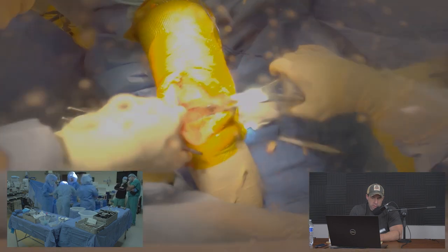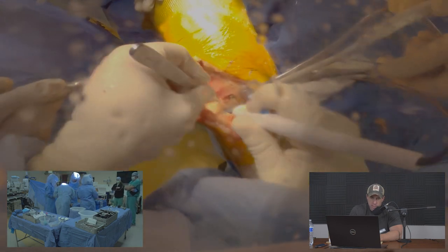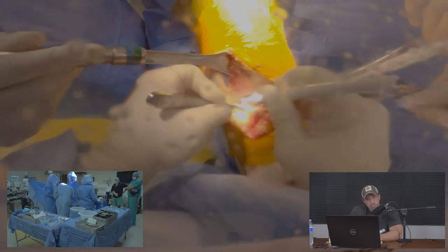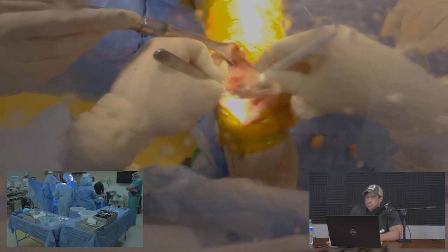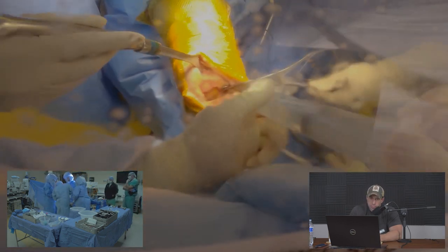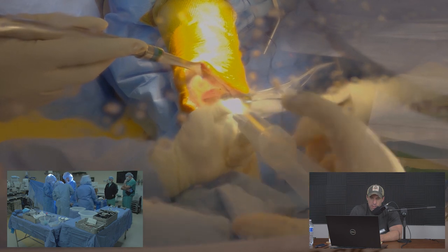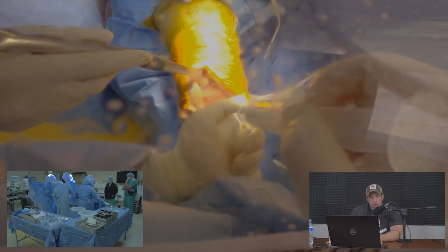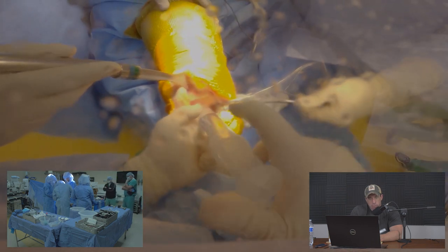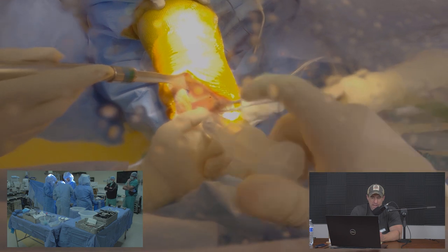The spreader is switched to the opposite side of the knee, retractors placed, and the same process is repeated to remove the lateral meniscus. I then inject a combination of local anesthetic medicines in the posterior aspect of the knee — the anesthesiologist has already completed a nerve block with long-acting local anesthetic, and this provides additional analgesia for the posterior portion not as well covered by the nerve block.